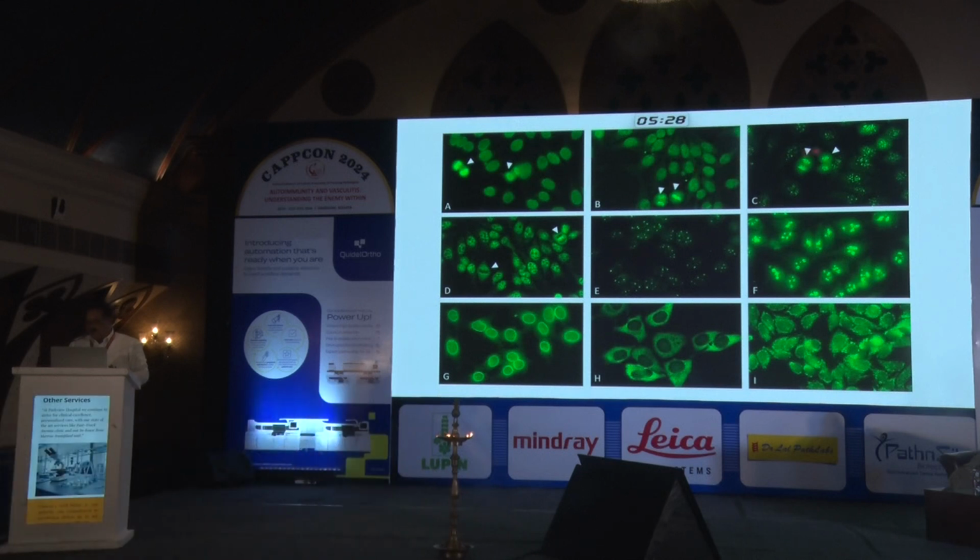This is the centromeric pattern, the speckled pattern, here you see the oligonuclear or multinuclear dots pattern, the nucleolar pattern, the rim pattern, the ribosomal pattern, and this is the AMA, or anti-mitochondrial antibody pattern. So these are patterns that we rely on in the laboratory to diagnose autoimmunity.